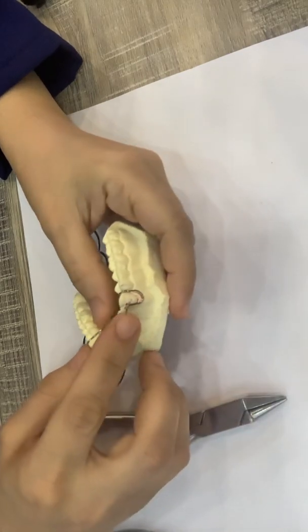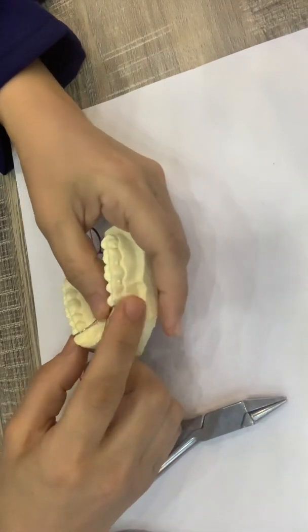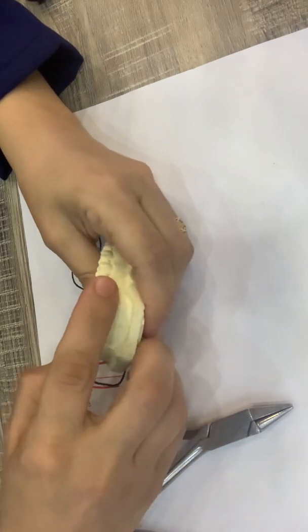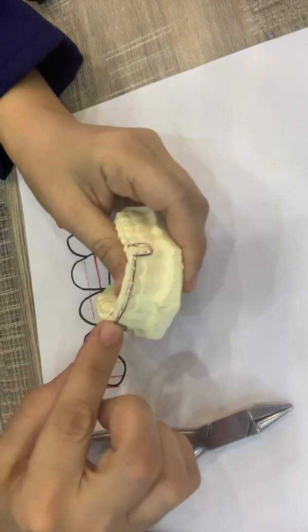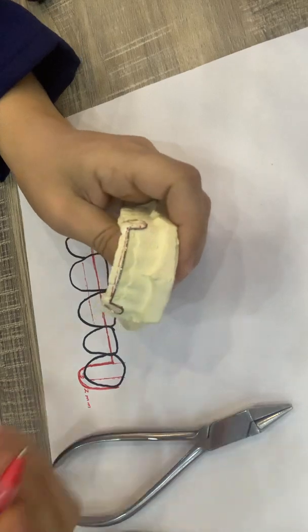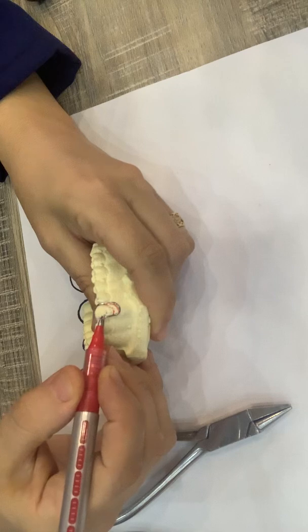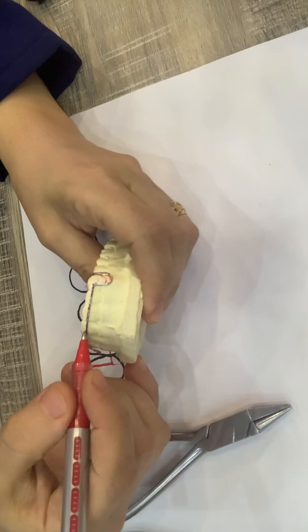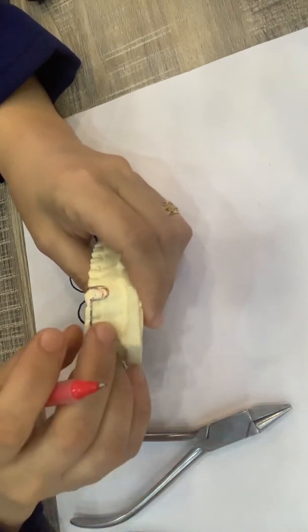Hawley arch is considered a retentive and active component of the removable orthodontic appliance. It consists of a smooth curved bow or labial arc. This is the labial arc. Its position extends from the medial third of the canine to the medial third of the other canine. Its height is located at the junction between the middle and incisal third of the incisor teeth.